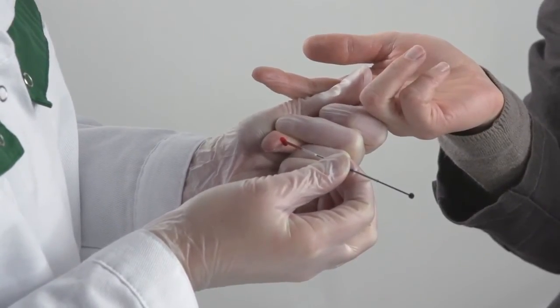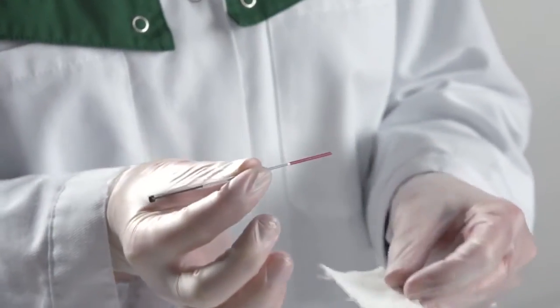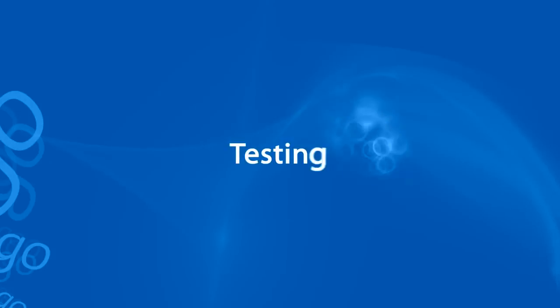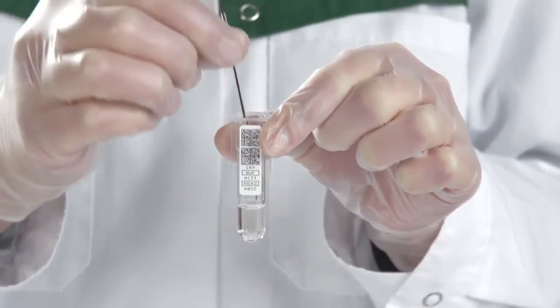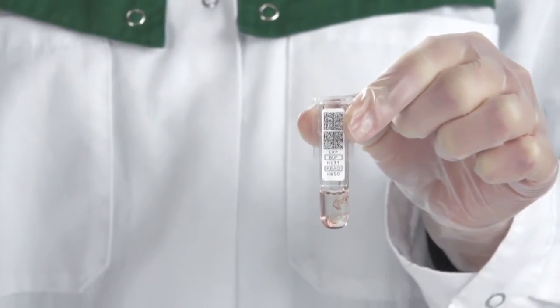In addition to the fingertip sample, venous blood, serum and plasma samples can also be used. Wipe the capillary with a paper or soft cloth to remove the excess sample from outside of the capillary. Place the capillary all the way into the buffer and press the plunger down. Make sure the capillary is completely empty. Discard the capillary and the plunger.